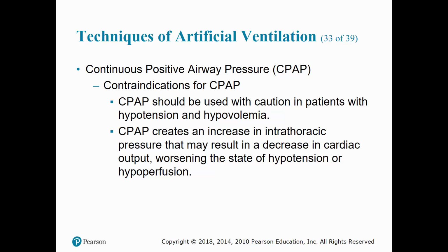However, CPAP is contraindicated in patients who are apneic or in respiratory arrest, have a GCS less than 11, are unable to maintain their own airway, or are unresponsive. If a patient is in shock or in cardiac arrest, we do not use CPAP, and if they are vomiting or have an upper GI bleed or history of recent gastric surgery.